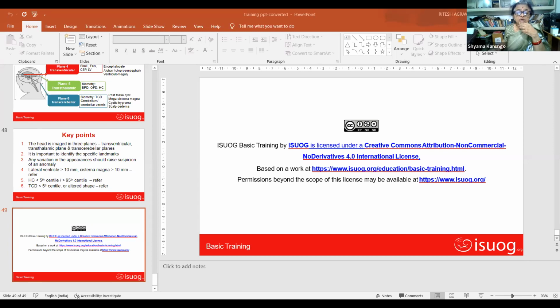The machine that they brought on the 16th and 17th, yes. I missed out this particular part, whether they had it or not. Anyway, it's very important for those who have been supplied with this HS Samsung. I know that GE has it. Otherwise, the application specialist can actually do it. Actually, if we give them a chart, the applications specialist, they can put it in the machine, I believe.